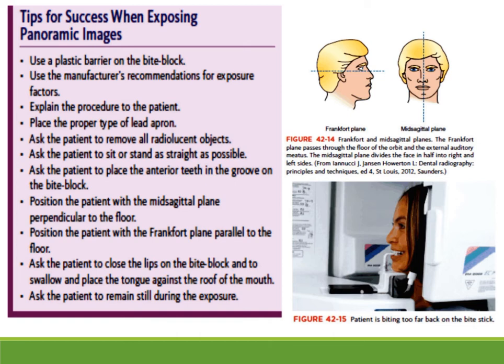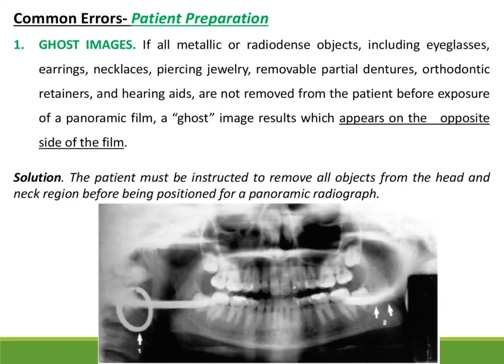Also, wearing a lead apron without a thyroid collar. Okay, so if any of these things are not followed, we can get errors.